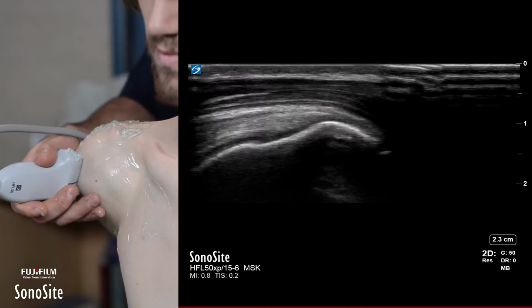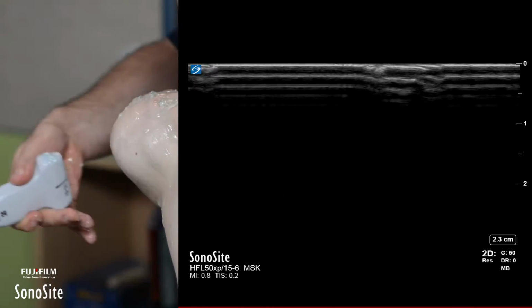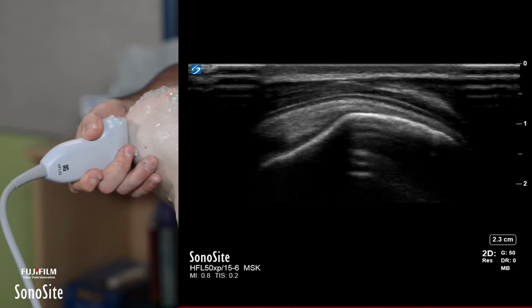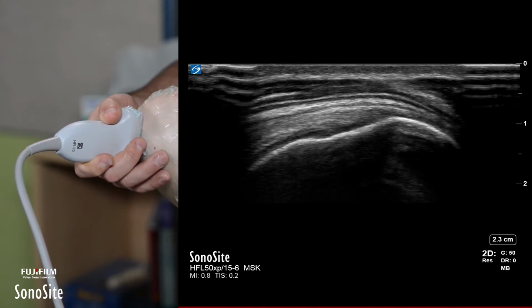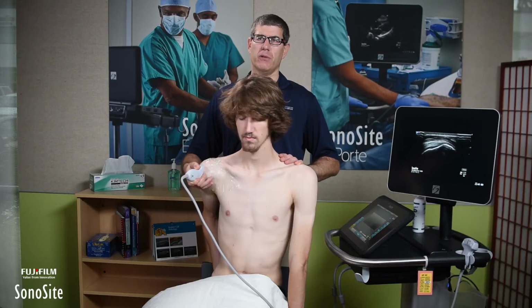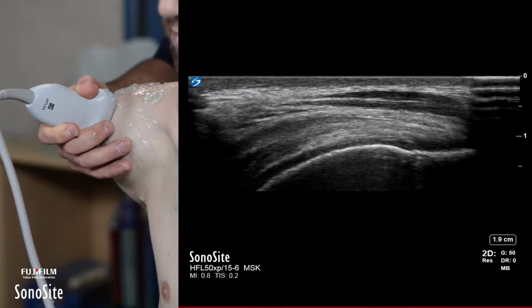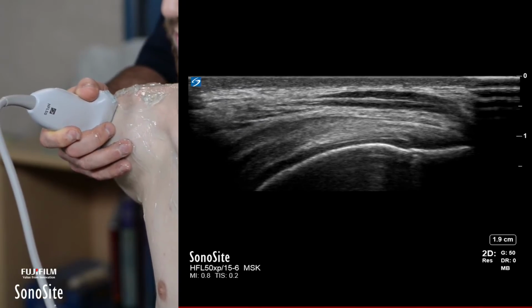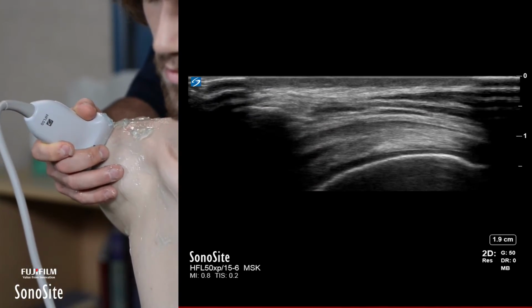And in this view, I'm looking long axis on the tendon, but if you look at where the probe is being placed, the probe is actually in a vertical plane. And this allows me to see the tendon in more detail with a wider field of view. So I see the deltoid muscle superficially. And there you can actually see the supraspinatus tendon extending over that really beautiful black hyaline cartilage of the humeral head.